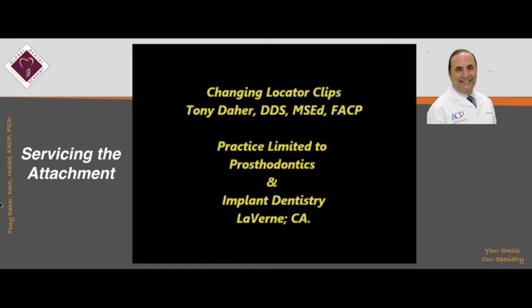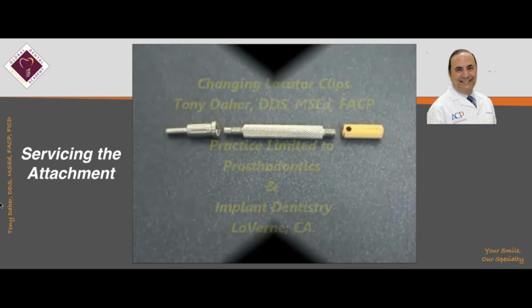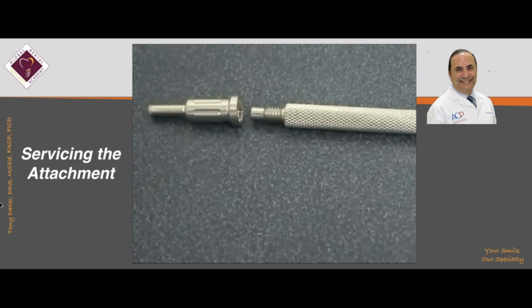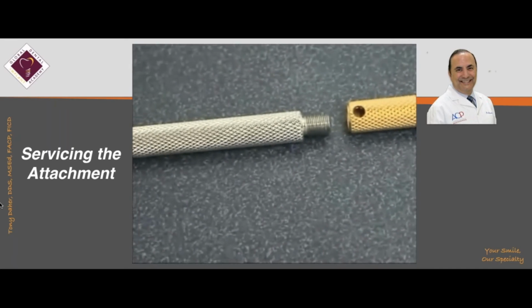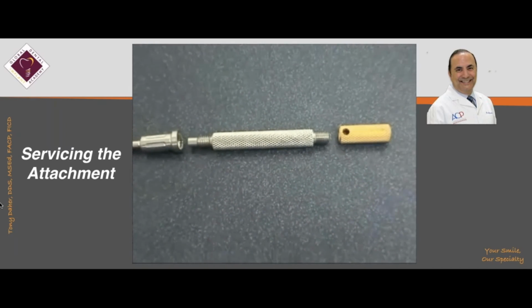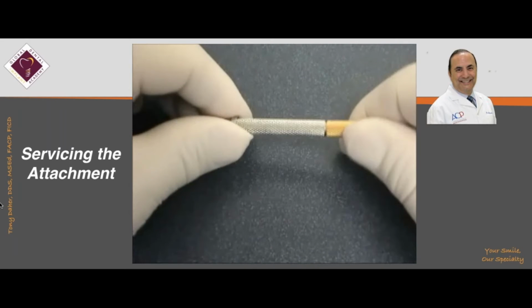Now, certainly sometimes you have to change these clips. I will show you the video how to change these clips. And this is the new 3-in-1 tool from the locator company, from Zest. So always the gold is the driver.